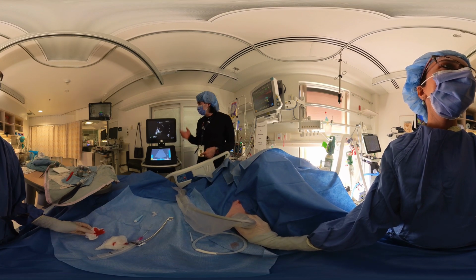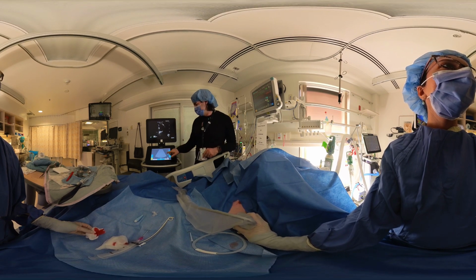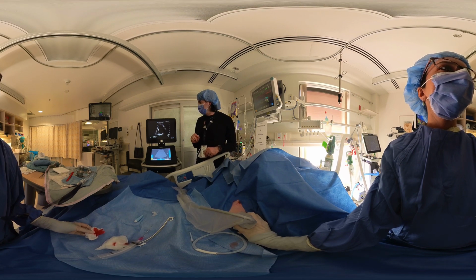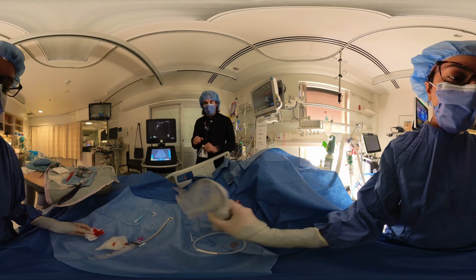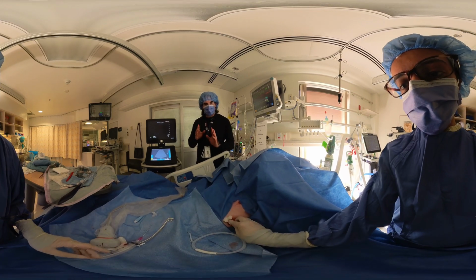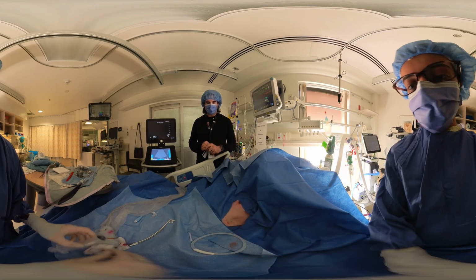Okay, so let's make sure our site is good. Again, we've already landmarked to make sure, but now we're just going to double check and make sure that the site is appropriate. Okay, it looks like you have a nice large anechoic space. Lots of room there, lots of space. So we are going to, again, we've chosen this site. So let's go ahead and put in the finder needle. Again, aiming for the rib first and then over the rib into the pleural space.